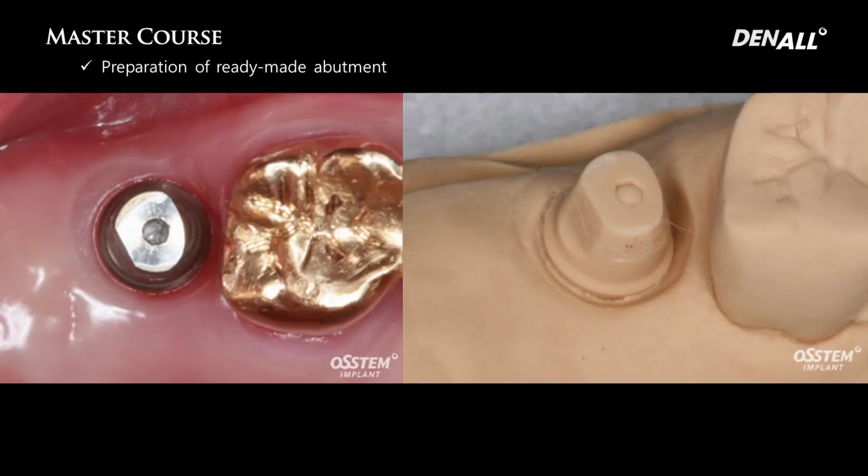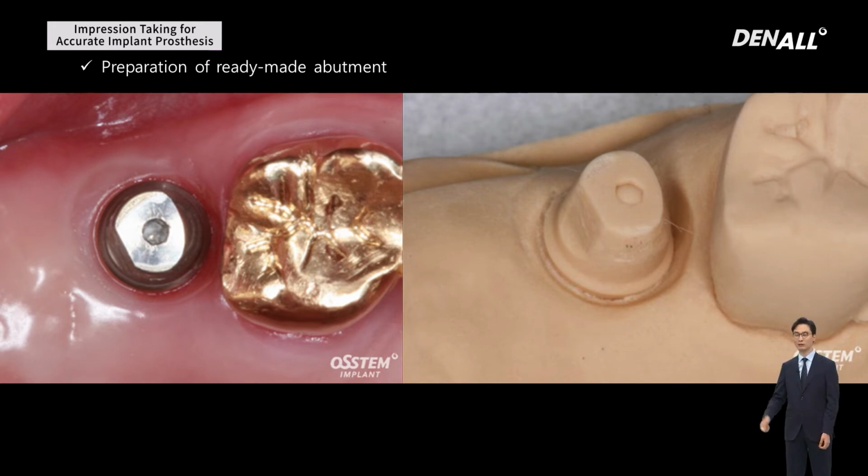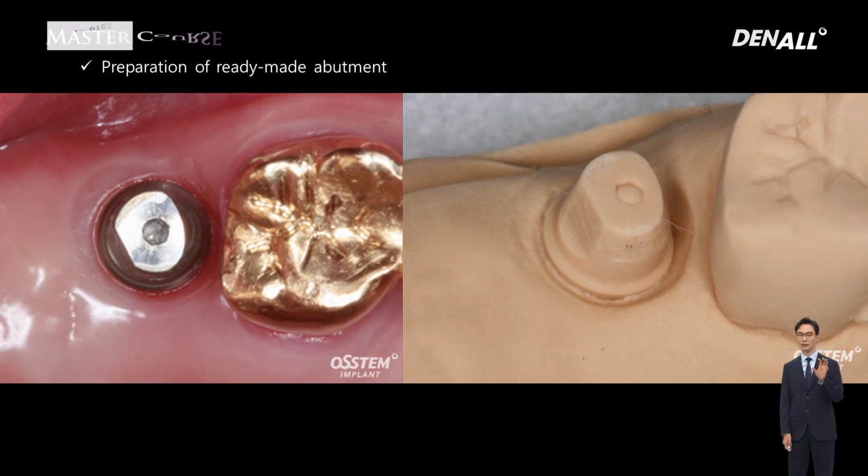If you connect one-piece type abutment and because of the space with the antagonist or the path with adjacent teeth, if you prep, you can only make a stone model using direct impression taking method. If you connected a stock abutment and modified it, you need to take abutment level direct impression.